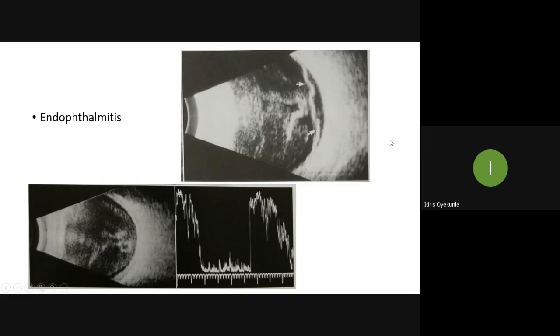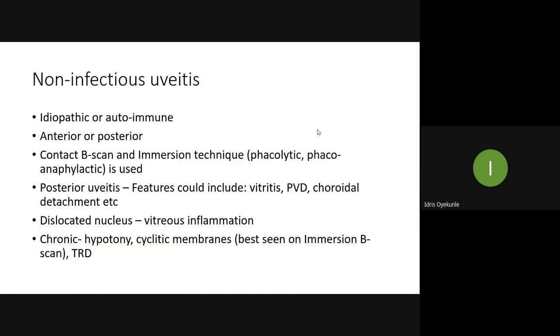A patient who has endophthalmitis will show varying mixed echogenic opacities in the vitreous cavity in the presence of bands, lines, and bright echoes. There may be some areas of abscess that would show varying internal structures and varying reflectivity. There is also the presence of retinal detachment, as seen with this arrow here. And that is why this scan is important.